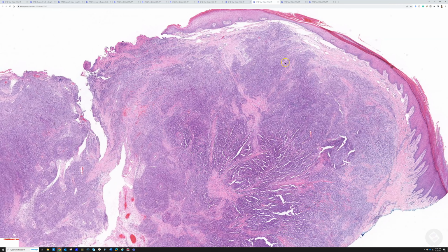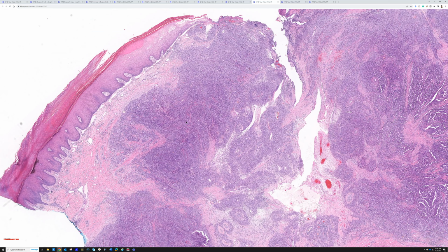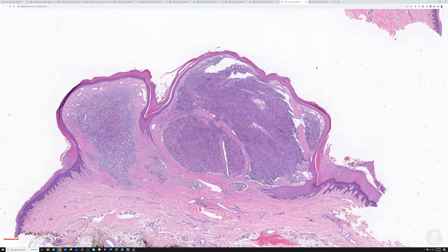So just remember that not all vascular tumors have blood, and if in doubt, do some vascular markers. If you're thinking of Kaposi, do an HHV8 stain. And this was a case that I'll always remember because of how tricky it was when the erythrocytes are not present. And then finally, we'll finish up here with a last quick little case.